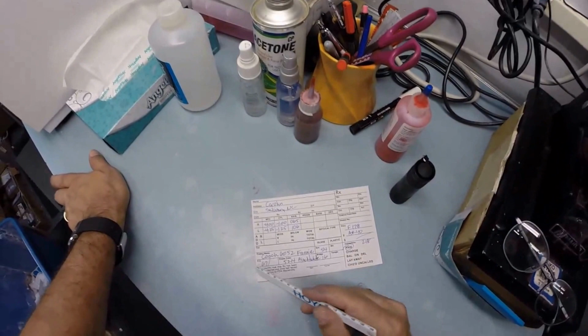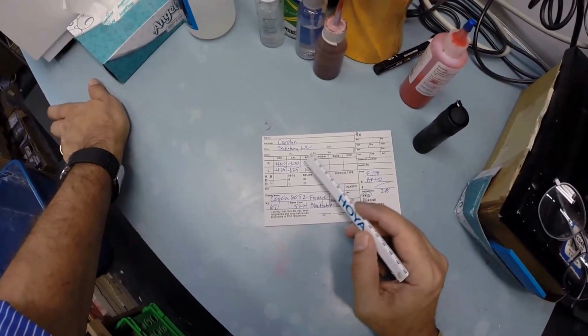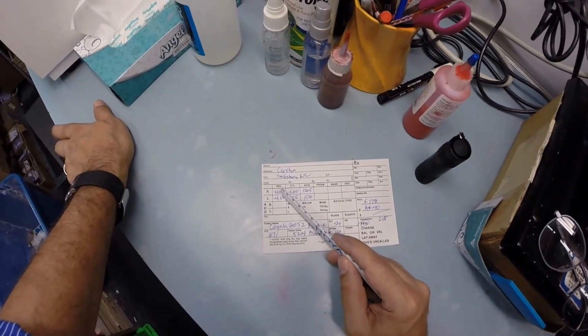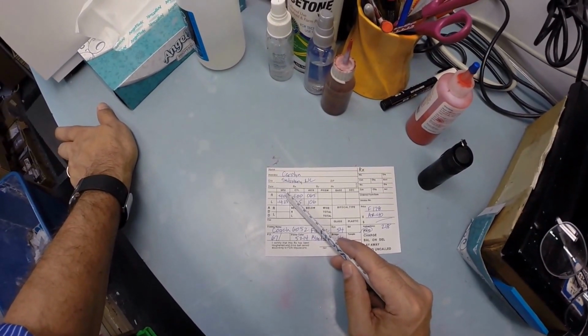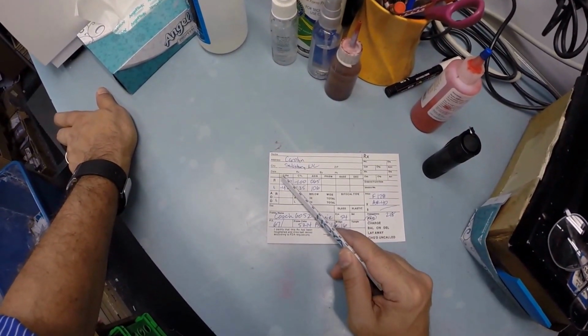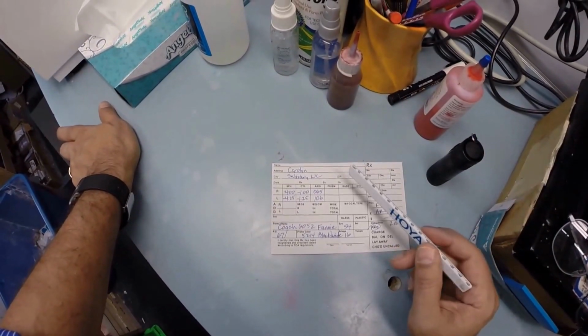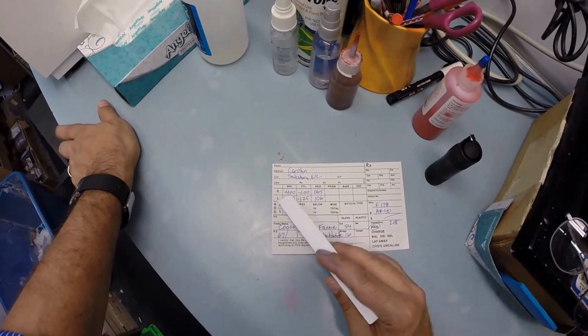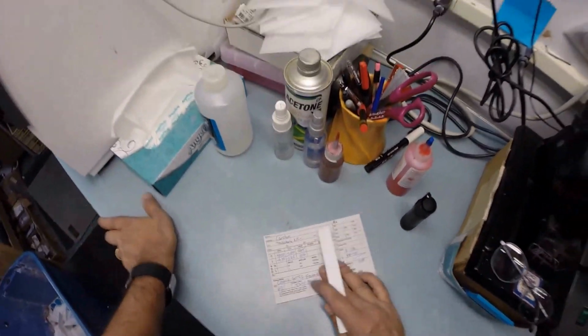So the unit of measurement we use in the optical world is called a diopter, spelled D-I-O-P-T-E-R. It starts at 0 and goes up in quarter increments from there: 0.25, 0.50, 0.75, 1. So at -4 you need 16 steps of minification. That's why there's a minus sign. Without your glasses on, everything is much too large in real life. So your lenses will minify down to the correct size.